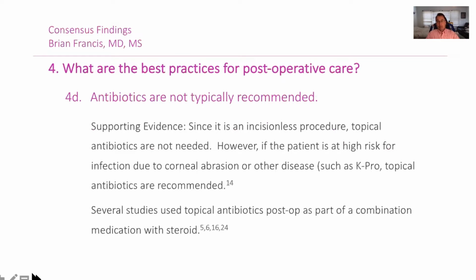Antibiotics, typically they're not recommended because it's an incisionless procedure. We typically do not use topical antibiotics either pre or post. However, there is one case in the literature of endophthalmitis following the procedure, and that was in a patient with a Boston K-Pro. So if a patient's at a high risk of infection, either due to corneal abrasion during the procedure or their other disease process, such as having a K-Pro, then we recommend topical antibiotics for 1 week, as you would do for routine cataract surgery. Several studies did use topical antibiotics postoperatively, but that was as a combination therapy with a steroid. So it was not a separate antibiotic.